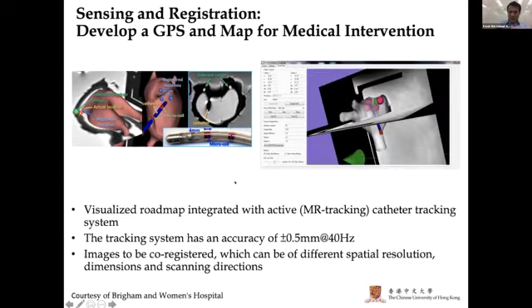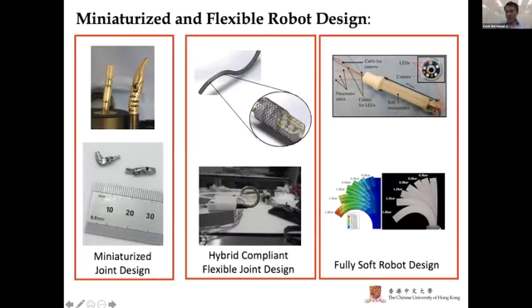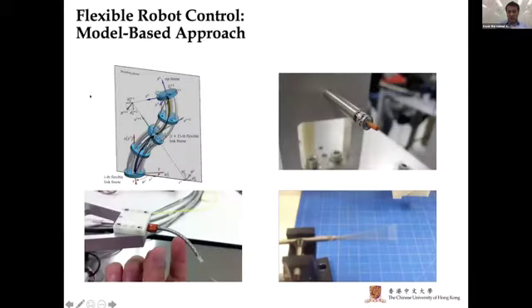In terms of hardware, I spend a lot of time building different kinds of flexible instruments. Some of the instruments can get to 3.5 millimeters in size, which is very important for pediatric surgery or when you do surgery around the ENT area, where you want something as small as possible. Part of the project became the Da Vinci Ion system. And here is the result of how we can use the optical fiber put in the instrument. The instrument here is a very early prototype. You can see we can really drive the robot at a very high speed.